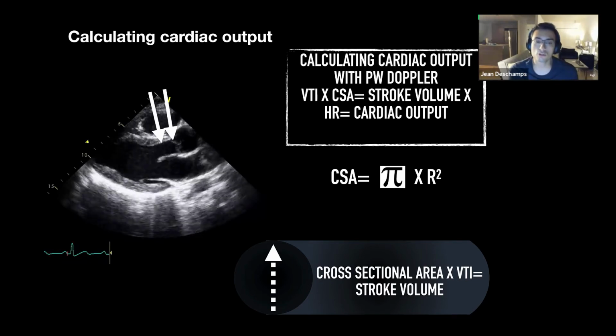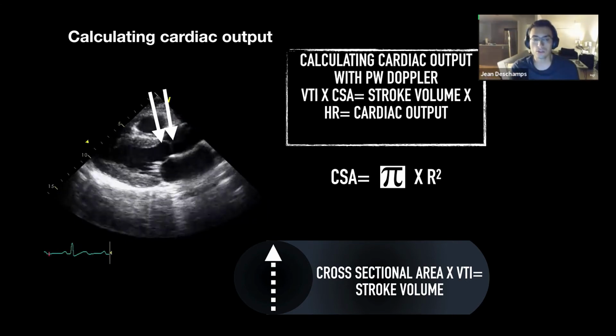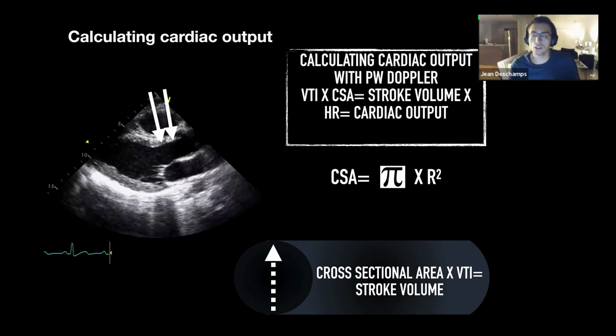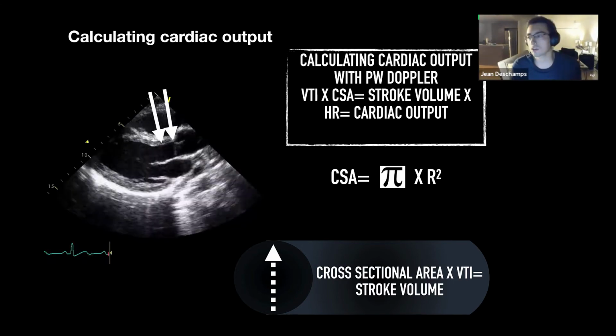The reason why we use a parasternal long view, and you shouldn't really use an apical view to measure the LVOT, is because of the way ultrasound functions. You're going to get way better resolution and less side lobe artifact in this view, and a very nice line to put your marker and measure. The second point is to measure where you would put your pulse wave Doppler gate. As we said before, it can be quite tricky to know exactly where you're at in an apical view. I would advocate instead to always put it in a standard way like you would in a cardiac echo lab, which is at the insertion of the leaflets. That way, from person to person, you would have the same, or as close as possible, LVOT diameter measurement, which might in the end make it more reliable than measuring exactly where you think you put your pulse wave Doppler gate.